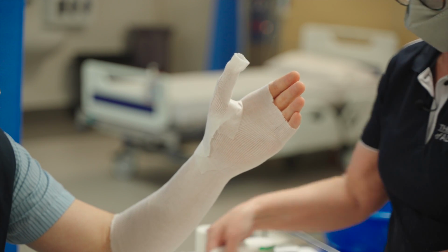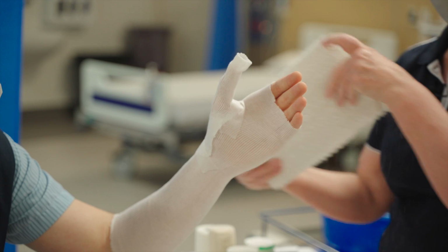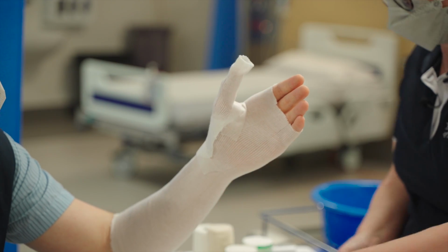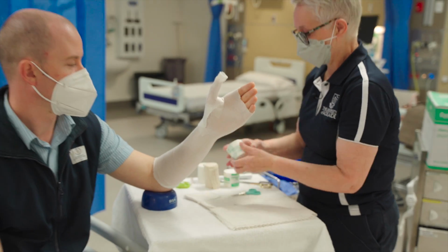So we've got that. Then we take our slab and we just make sure that our slab is also at the correct length as well. So we know those are all correct. Now we'll go and put some padding on.